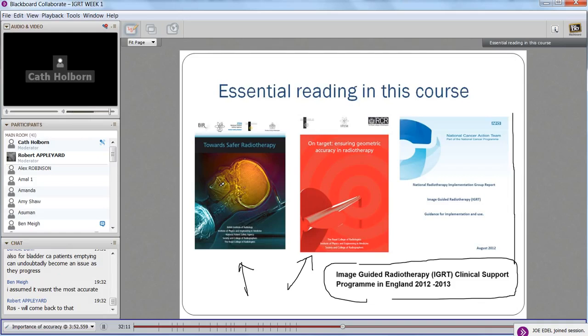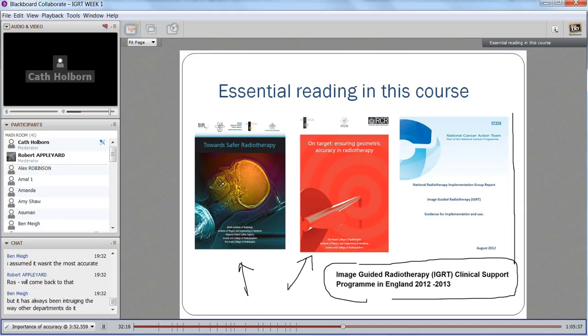And then the radiographers on the treatment set each day would use the plan that fit best the bladder size and position that day. But what they would normally do first is do a positional correction. So get as close as possible to where you need to be, and reduce the error as much as possible through a positional correction, and then find the plan of the day that best fits the size and position of the bladder. So I don't know whether anybody is doing that, but that's one example of adaptive radiotherapy.